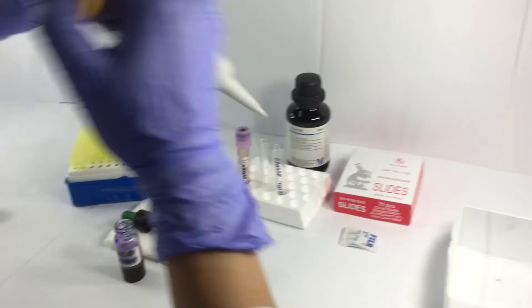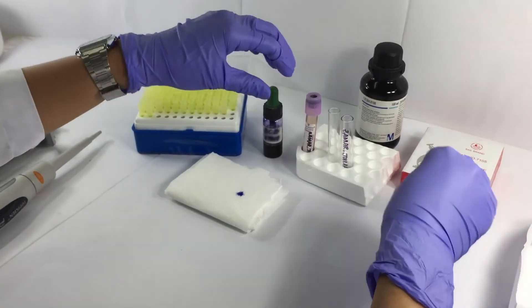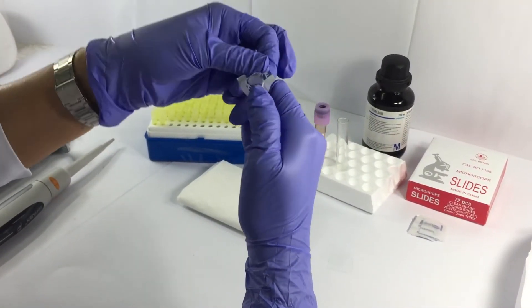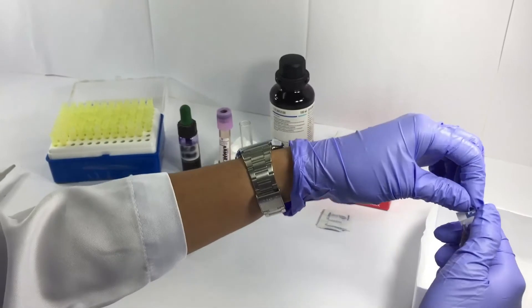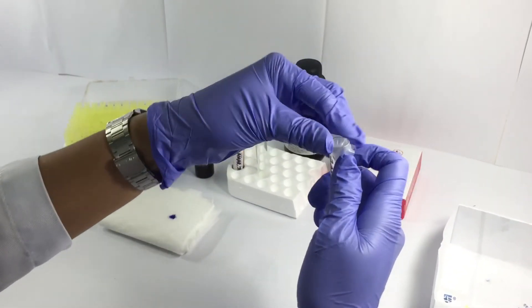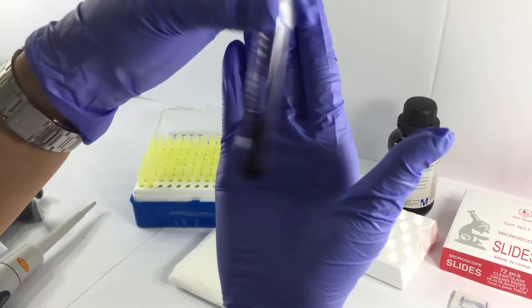After discarding the tip, recap the container of the supravital stain. After which, get a piece of parafilm to cover the test tube containing the mixture of the patient's blood sample and the stain. Gently shake the tube and incubate at room temperature for 3 to 10 minutes.